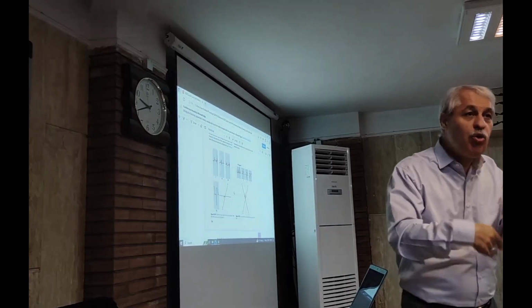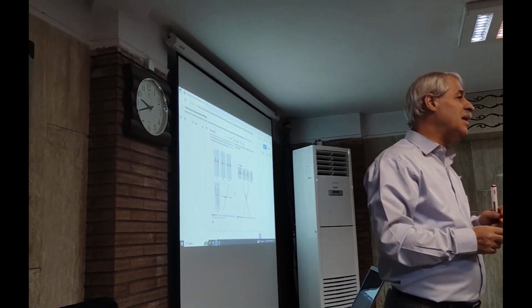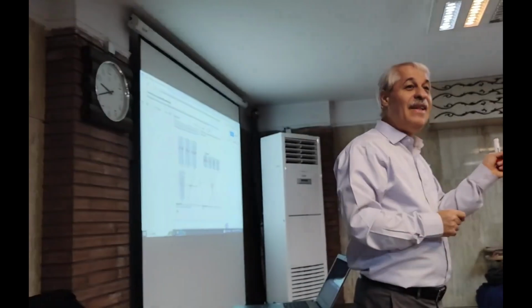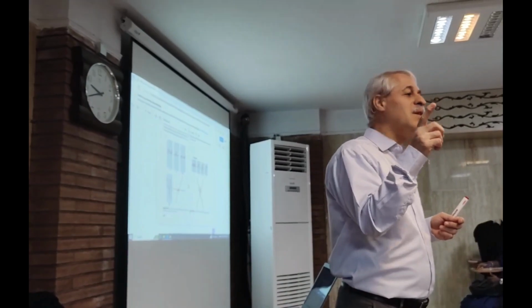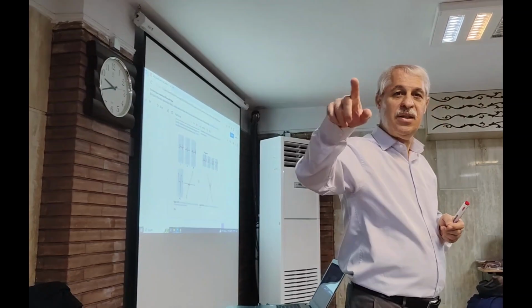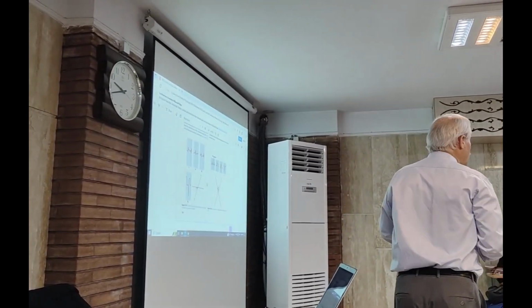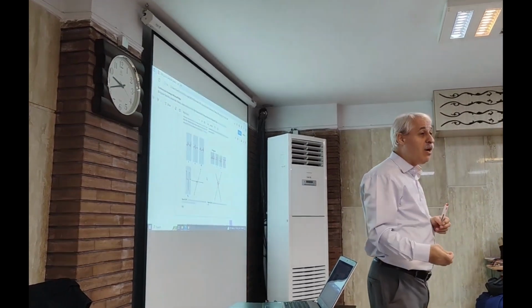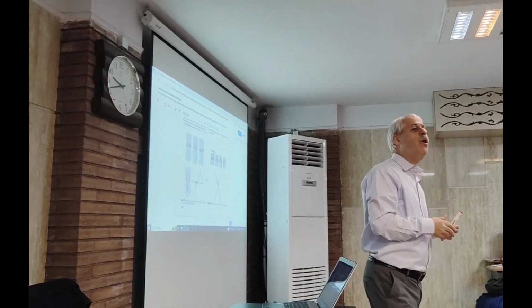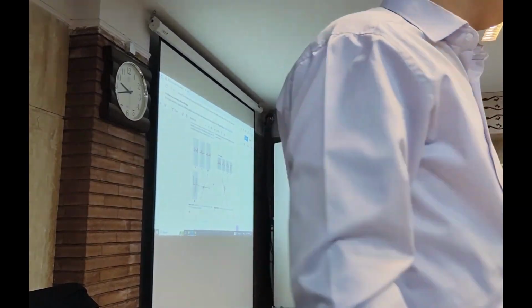So, if the sequence of repolarization changes, means instead of starting from the apex, it starts from the base, then the direction of the vector of repolarization in the ventricle would be inversed. And instead of a positive T wave, you will have a negative T wave. This is a sign for myocardial ischemia.